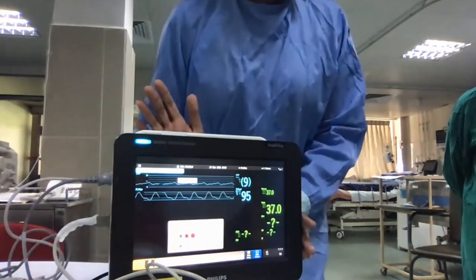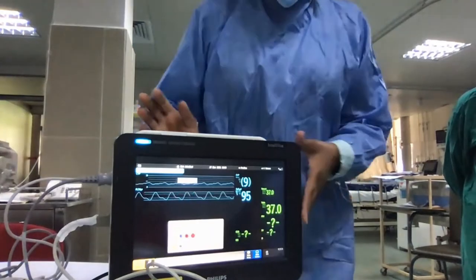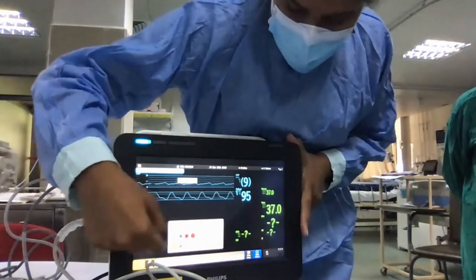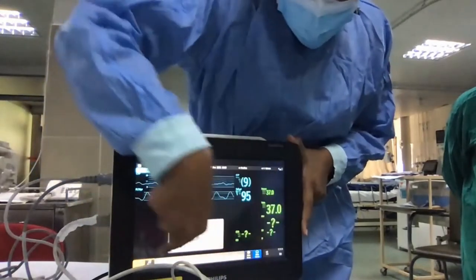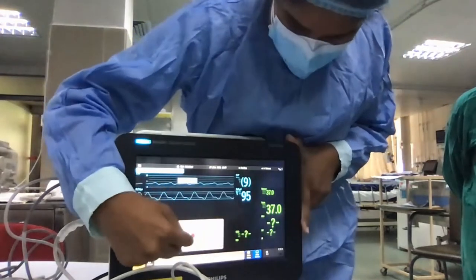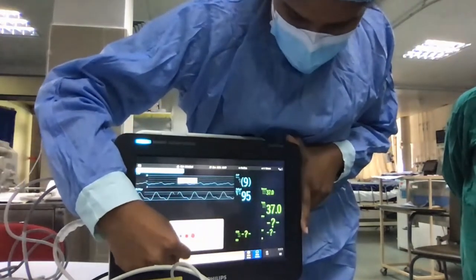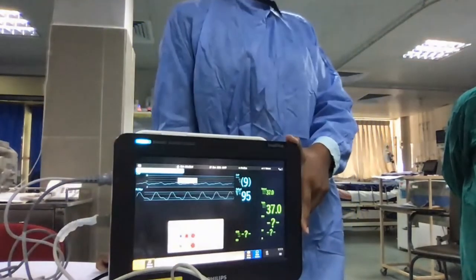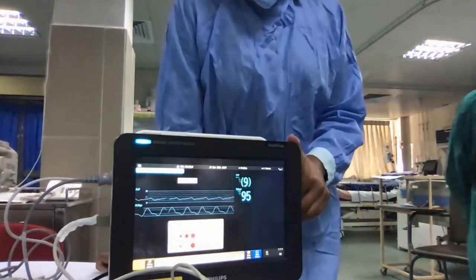So if you get a scenario like that, first of all, what you have to do is just activate that port. How to activate it is, there is a pop-up menu on the bottom. Then there is an icon called activate. Just click on it and that will activate the port. I think you all have got it.